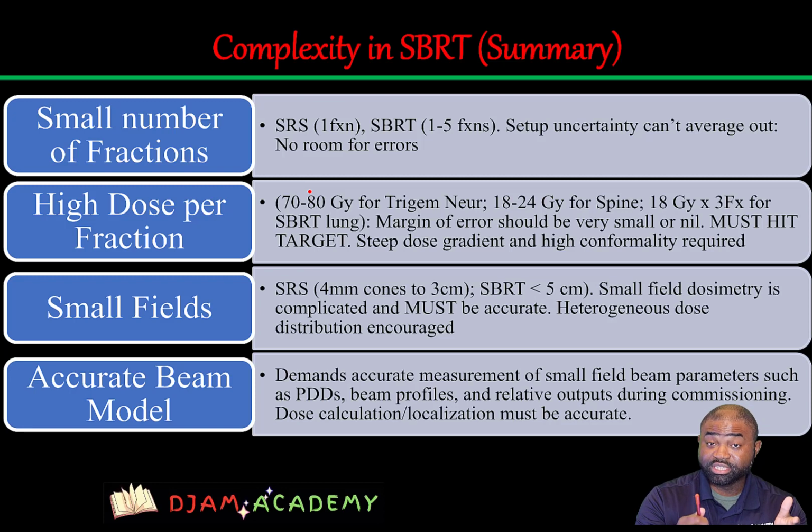What this means is that setup uncertainties cannot average out as compared with conventional treatment. And because they cannot average out, there is absolutely no room for error.